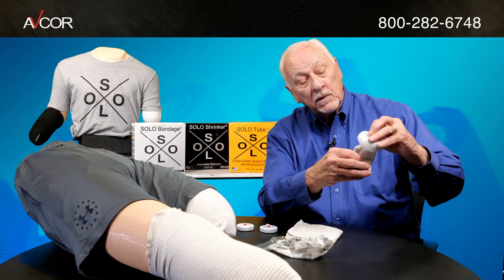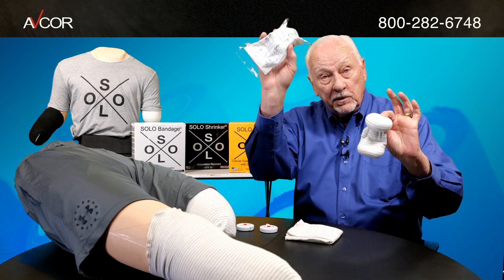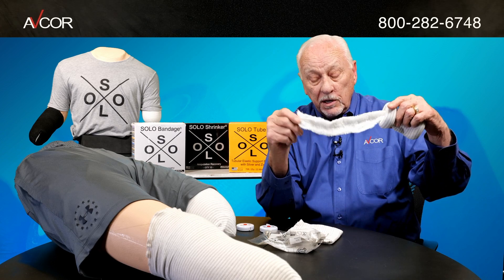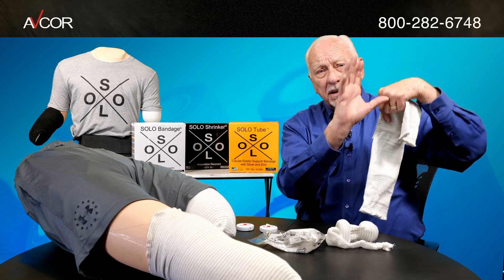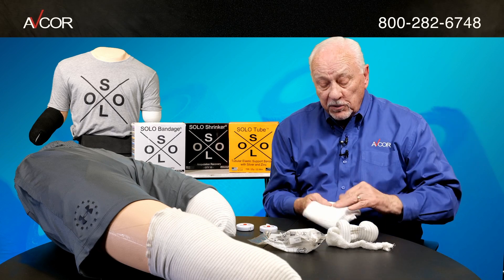The product itself is very simple. It comes in this package. It has a bandage that already has your gauze knitted in, and you will notice that it has a very unique sewn-in scallop design, so it fits very well around the stump of the amputation.